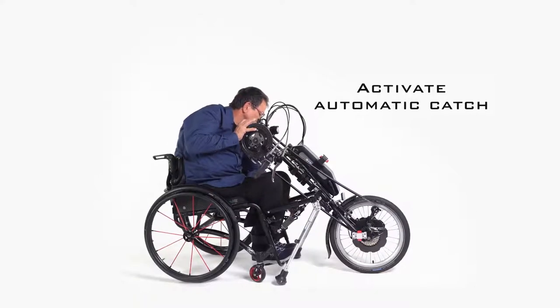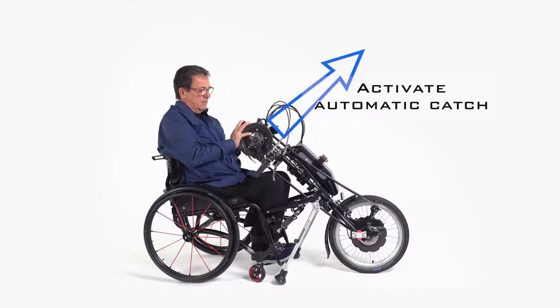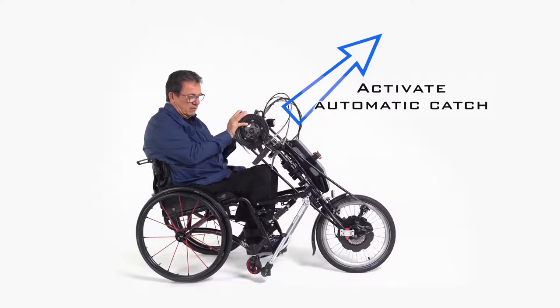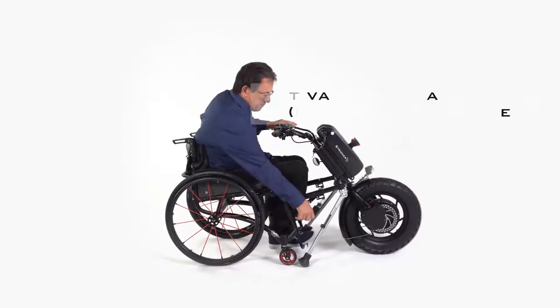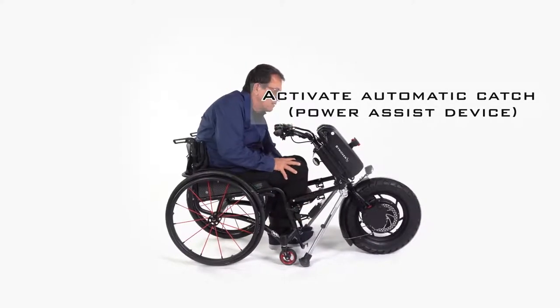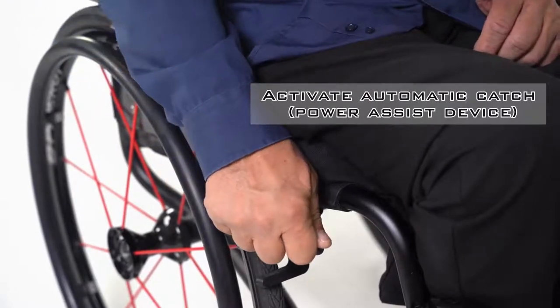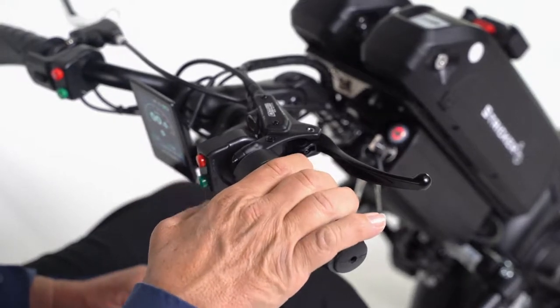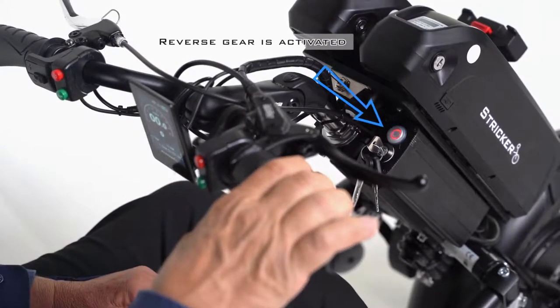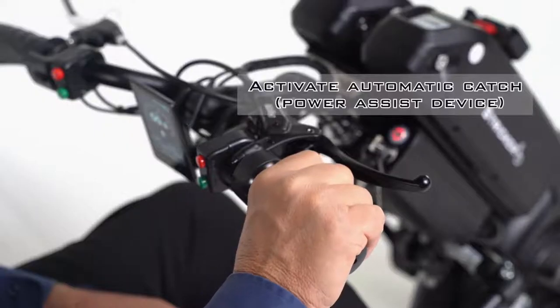Now lean back a little in the wheelchair and push the handbike on the grab handle, or the power assist device on the handlebars, upwards until you hear a clicking sound. If you have a power assist device with reverse gear, you can use it to bring the bike into the driving position. To do this, lock both parking brakes on your wheelchair and activate the reverse gear on your power assist device, then slowly and carefully turn the throttle until you hear the click.